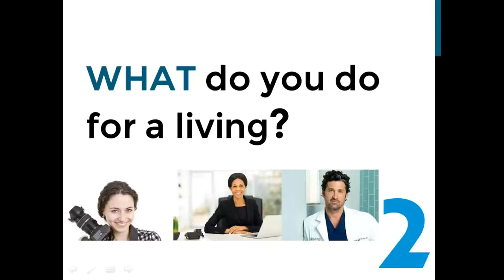They actually welcome it. And so you tell them, like we do, I assume, that they may need extra light in certain conditions. Absolutely. And I found, I'm sure you did as well, it is a slow healing process, but it just keeps getting better and better and better, that extra light that you need right in the beginning when you get the inlay versus later on it just works better. I can read menus now in dim light, whereas I would say maybe 6 months out, I was still having to look for extra lighting. So it just continues to get better and better.